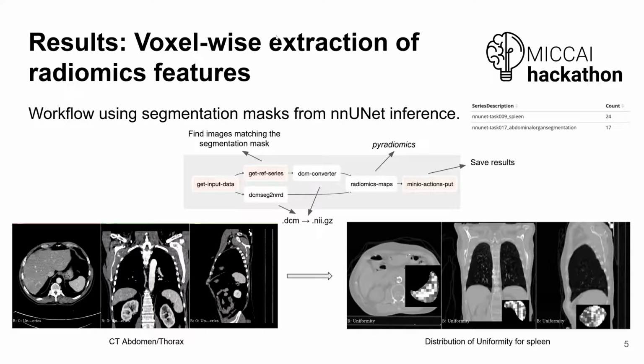an image matching the mask, and then they were both converted into NIfTI and based on PyRadiomics, our model created basically parameter maps describing a particular radiomics feature.